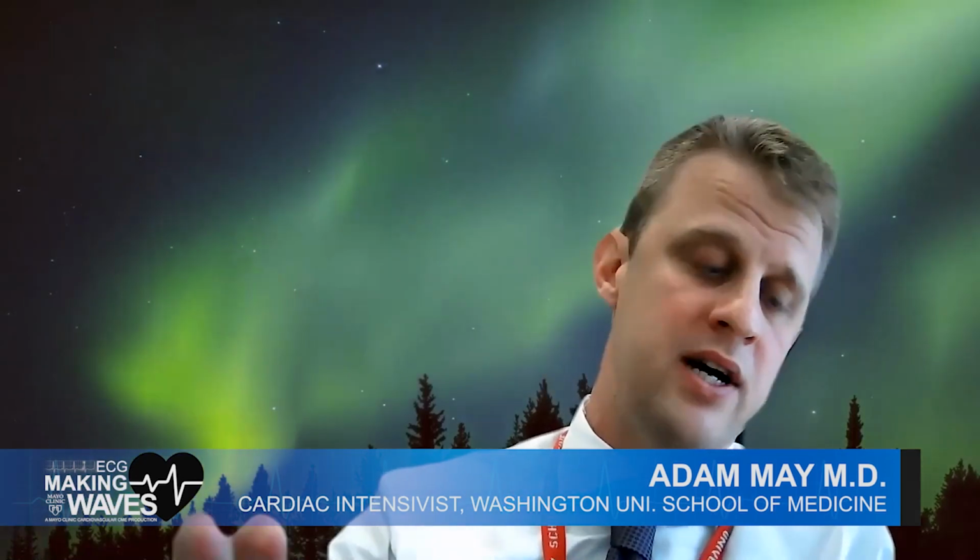So yeah, that's a great question. When we're talking about automated methods, you certainly can use them in two different ways. One, you could just have an outright diagnosis provided to the clinician, be it VT or SVT. The other avenue that we're going to take is establishing a likelihood of the diagnosis.